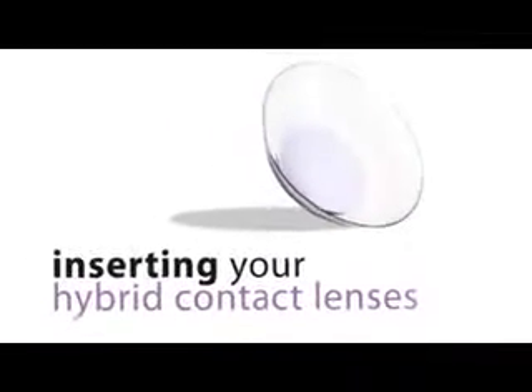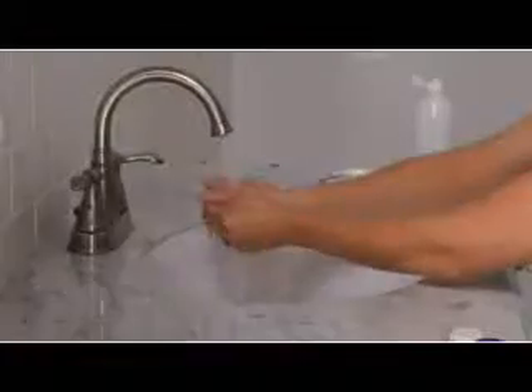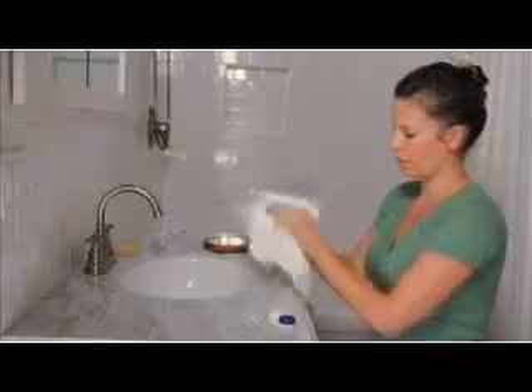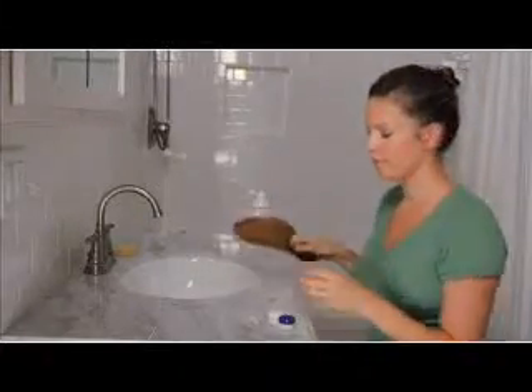Now let's take a few minutes to review how to insert your hybrid contact lenses. Any time you handle your contact lenses, it's important to thoroughly wash your hands with a mild, lanolin-free soap and then dry them with a clean, lint-free towel. It's good practice to always handle your lenses in the same order to reduce the risk of getting them mixed up. So let's begin with the right eye.